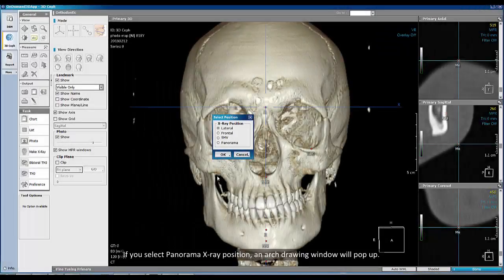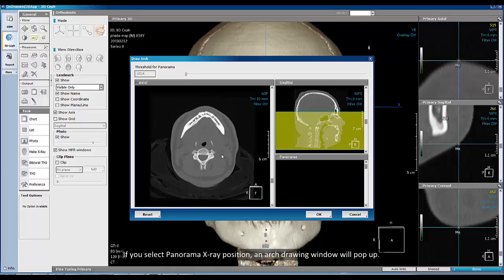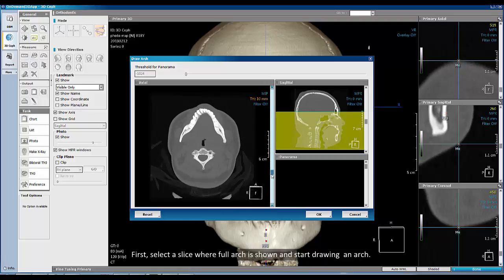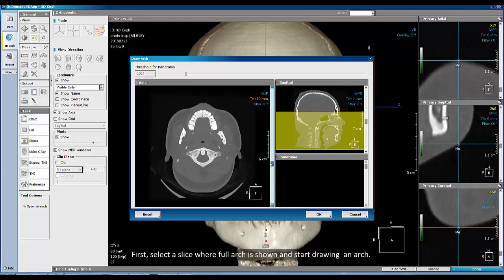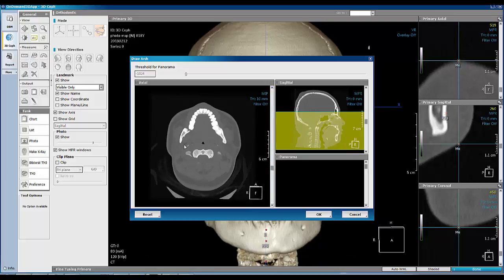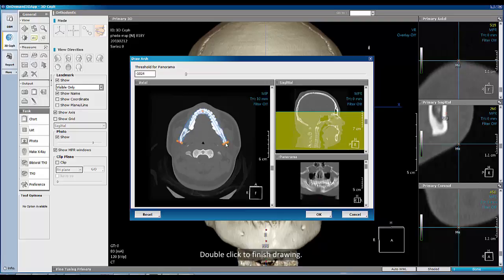If you select panorama x-ray position, an arc drawing window will pop up. First, select a slice where the full arc is shown and start drawing an arc. Double click to finish drawing. The panorama image is shown when the drawing is done.